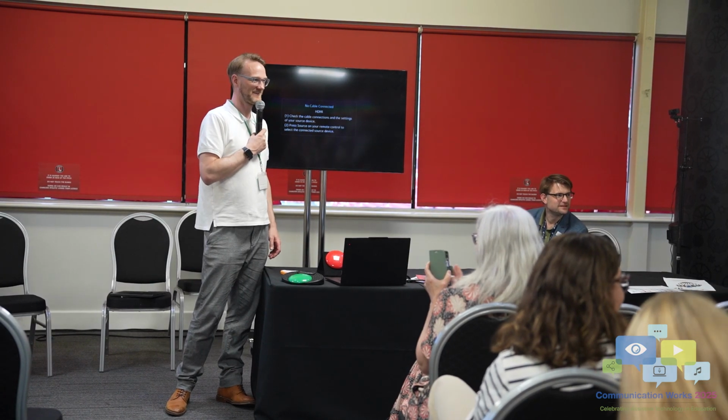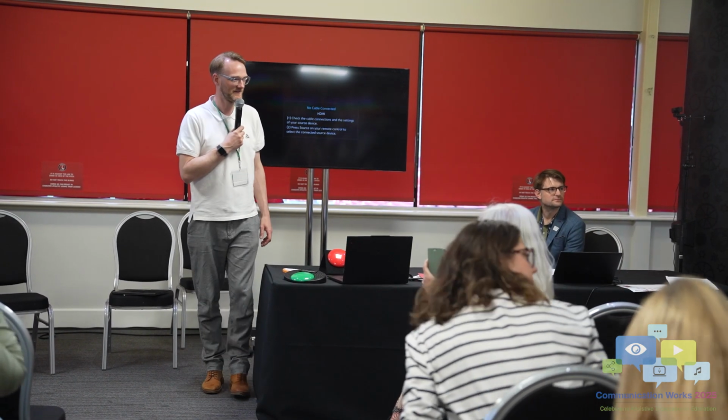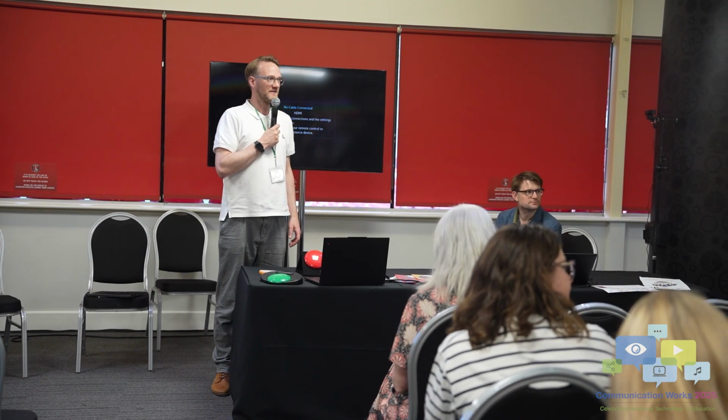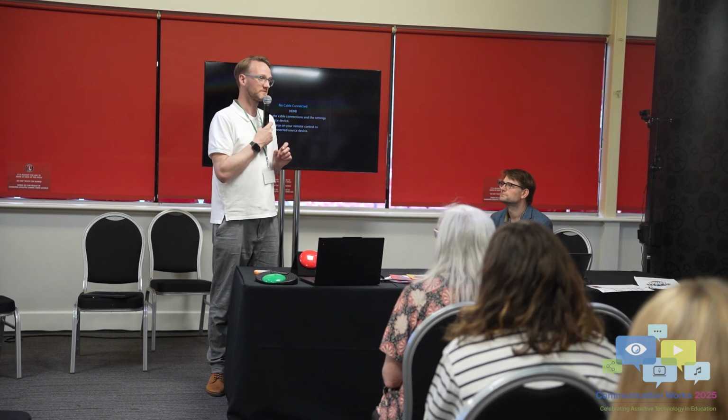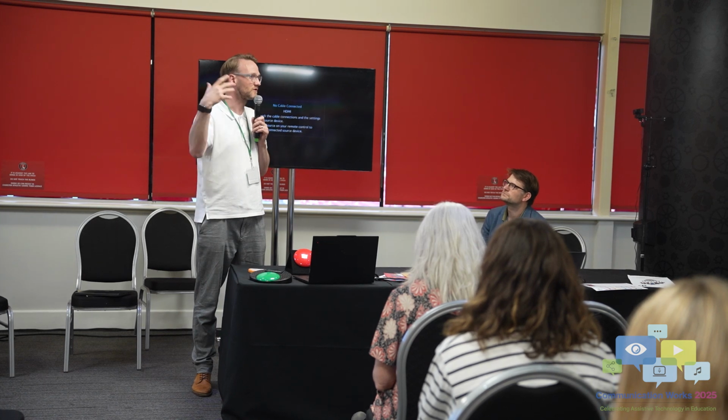I'll keep it simple. In terms of the stage you're at here, we know what switch we're using, so is there a stage even before this, or are we still tweaking what type of switch that person should be using? So I find often when it comes to the children I work with, the type of switch can change even during the day. In one of the videos you saw a proximity switch, which is often used with children that can't really put force onto the switch to activate or target with their upper limbs.